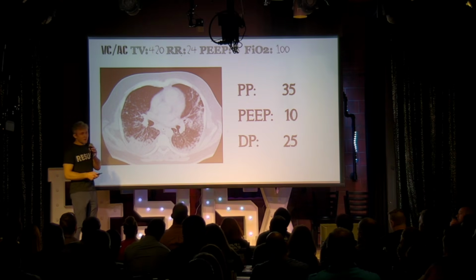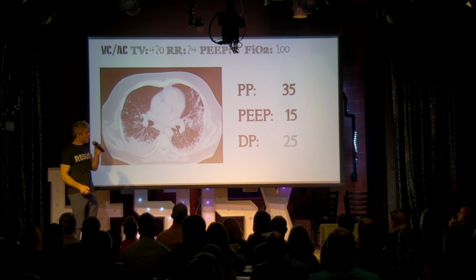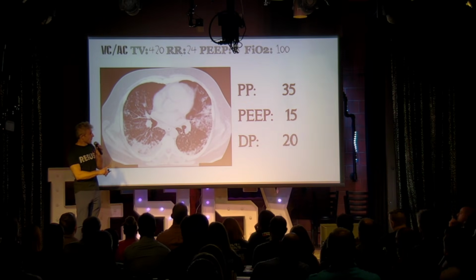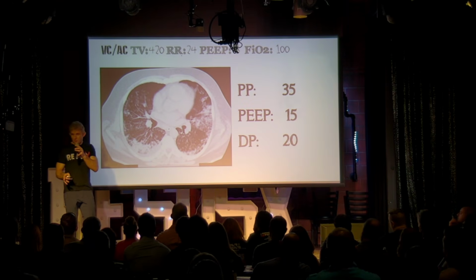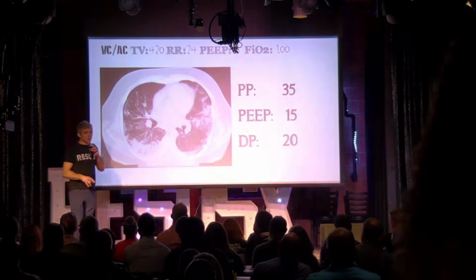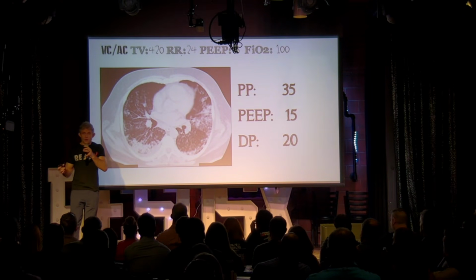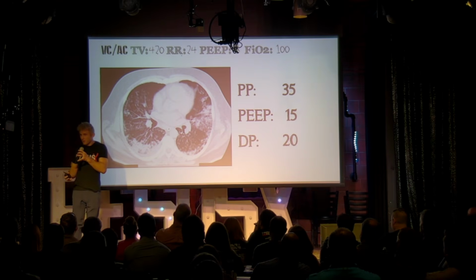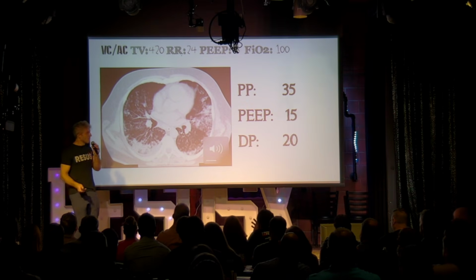So what I would say the next step is, you're only at a PEEP of 10. Let's try again. So we go up to a PEEP of 15. My plateau pressure stays at 35, and my driving pressure drops to 20, and I recruited more lung. As my driving pressure drops for any given tidal volume, I know that I have more lung that's participating in ventilation. So this is a really nice way to check if the patient is responding to the PEEP you're giving. So now what do you guys want to do?